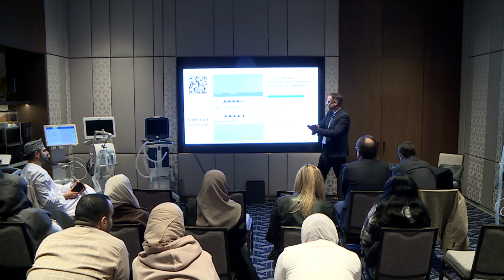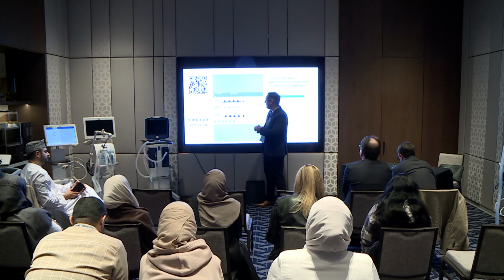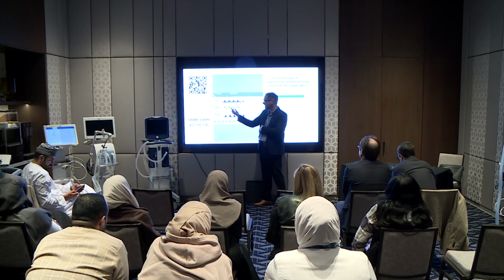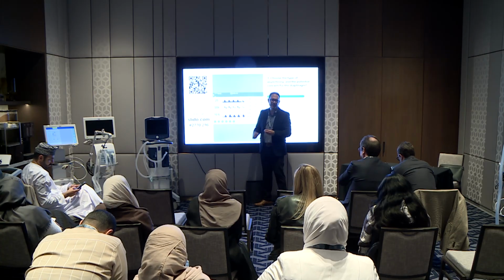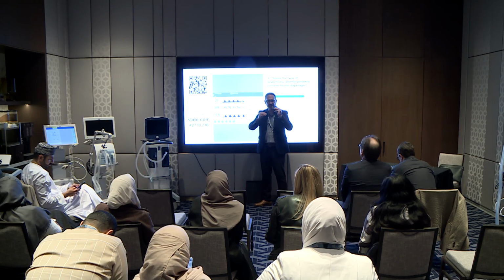Reverse triggering, very good. There's no evidence of patient trigger, right? They're not triggering the ventilator. Anyone who put ineffective efforts: if this blip was more in between, sometimes you can have two before the next breath, depending on how hyperinflated they are, but they're usually not this close. Again, if you had esophageal pressure, there'd be no question. But it's training the eyes to see and think it through.